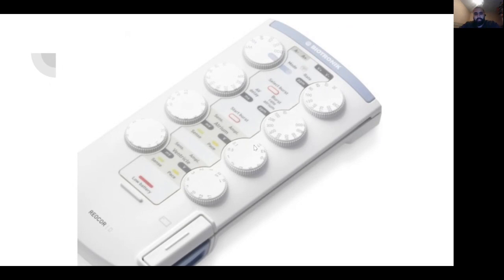Burst rate, we don't use it, forget it. And these are your 4 key components for determining the electrical output. The ones on the right, amplitude and voltage: this is the amount of energy that the pacing box is going to deliver to the heart in order to try and pace it. That is amplitude.